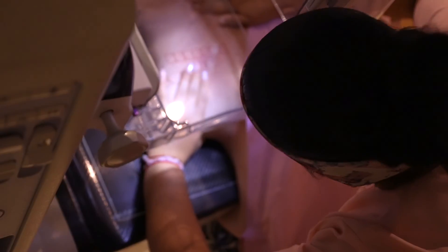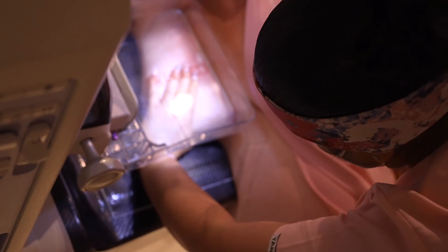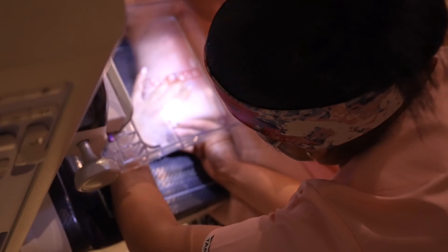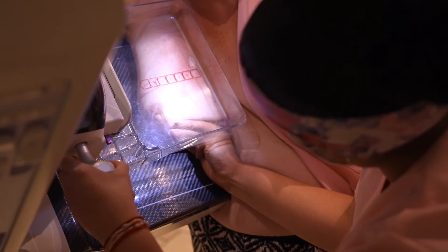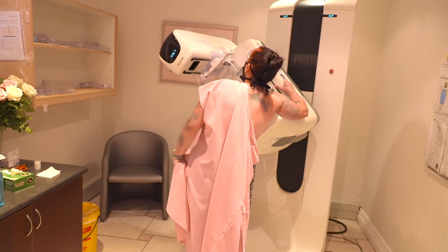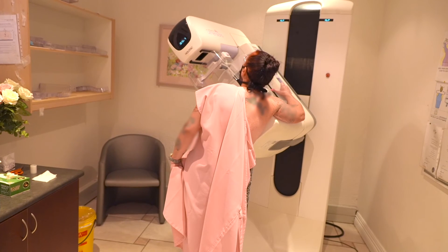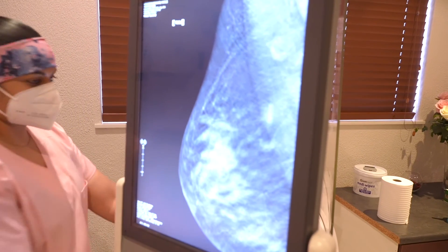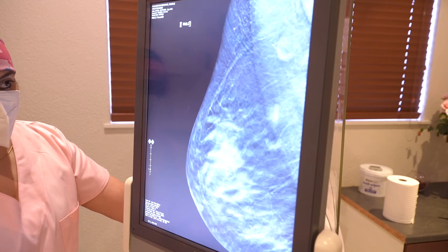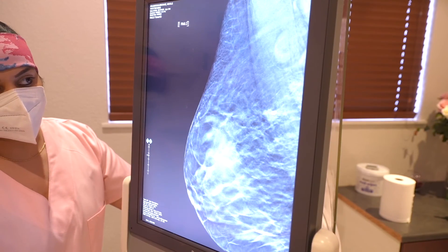One of the benefits of this marker is that due to it being made from nitinol, it is clearly visible under x-ray, ultrasound, and MRI. Here, imaging using tomosynthesis shows the depth of the marker and area of biopsy, with the twirl marker beautifully visible in its identifiable round shape.